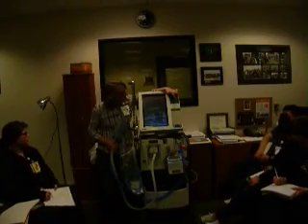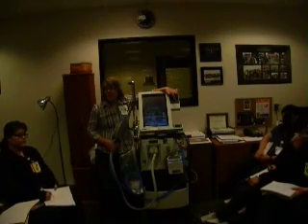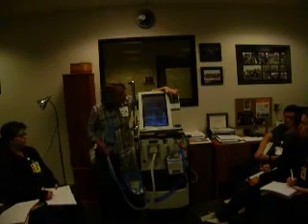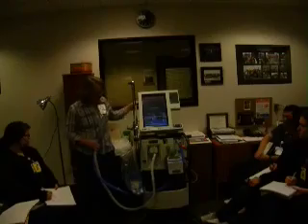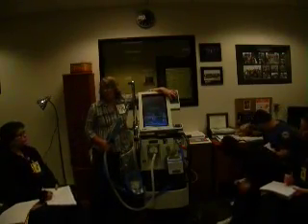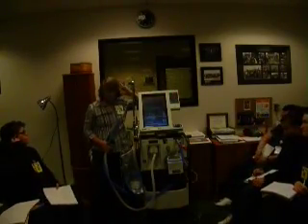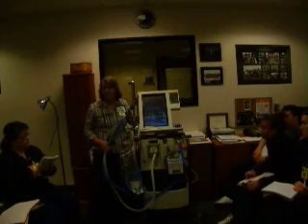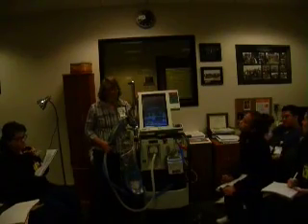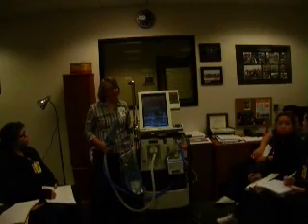Also up here, you'll see your sensors for your air compressor. It tells you now, because we're using the air compressor, it says ready and on. Normally it would just say ready. That tells you the air compressor is ready to use. Batteries ready and on. If we unplug it, which I'm not going to because I've got to crawl underneath the desk, the on indicator will come on and let you know that your battery is being used. That's not meant to take a patient outside around the parking lot. That's like emergency until you can get to another power source. They do not last long. I think you could imagine that a battery inside a machine like this would not last very long.